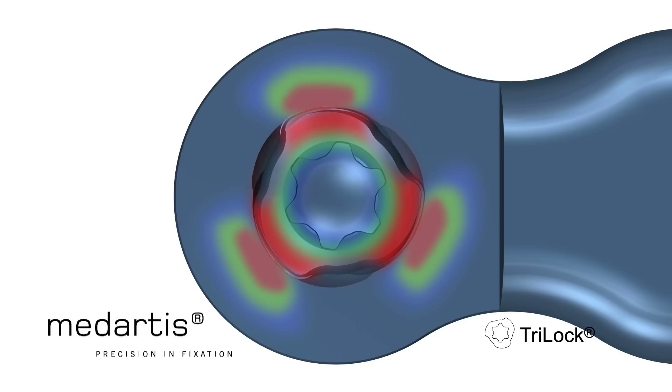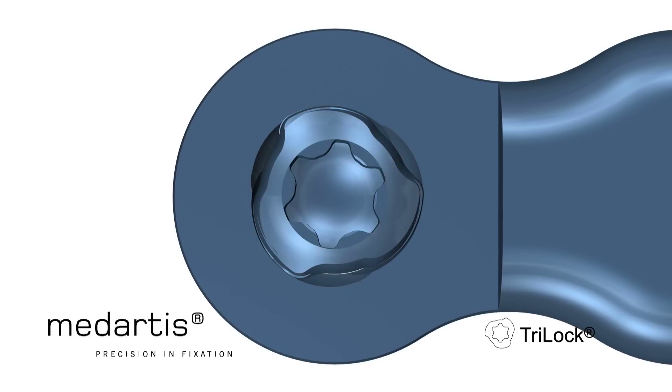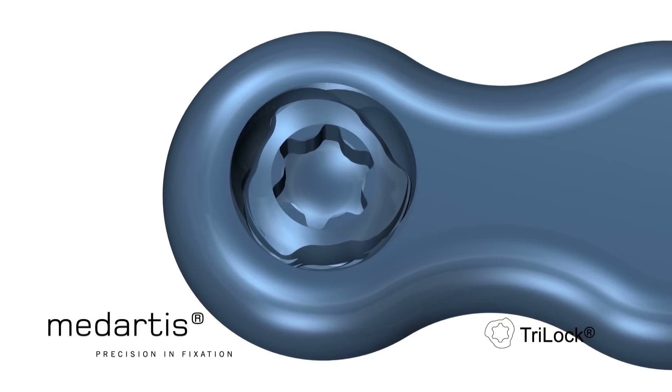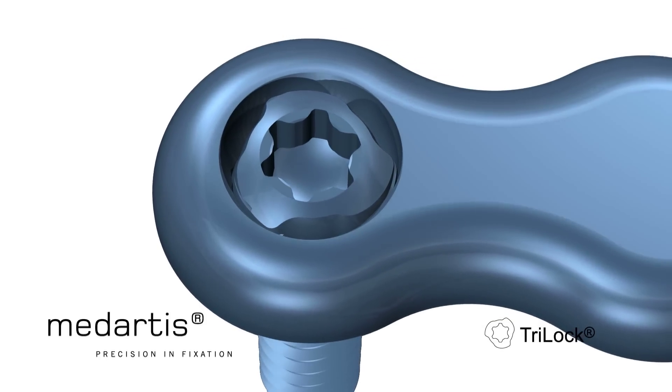This resulting radial force or friction connection between the screw head and plate hole creates the secure and angular stable wedge locking. A distinguishing feature of Tri-Lock is its multi-directionality.